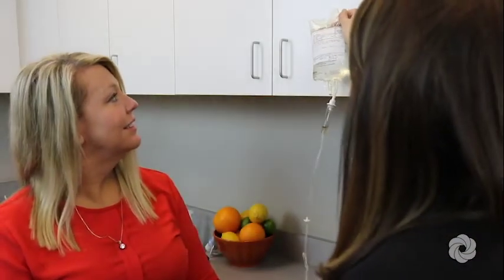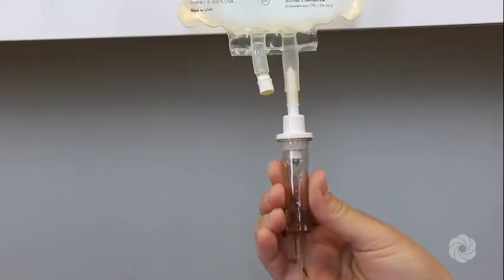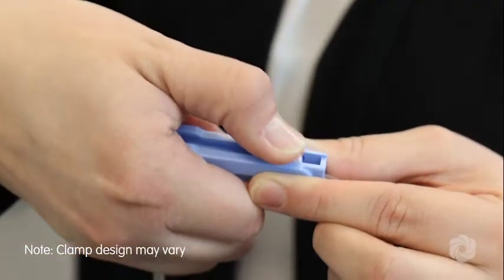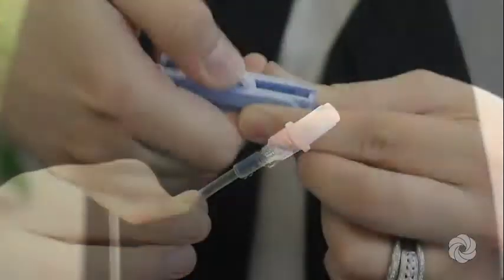Hang the IV medication container on the IV pole. Gently squeeze the drip chamber to fill it about half full of fluid. Do not overfill. Lastly, slowly open the clamp to prime the tubing, filling it with medication. When the medication reaches the end of the tubing, close the clamp.